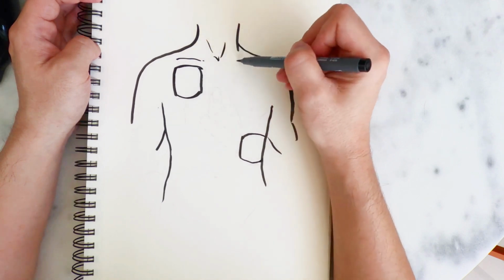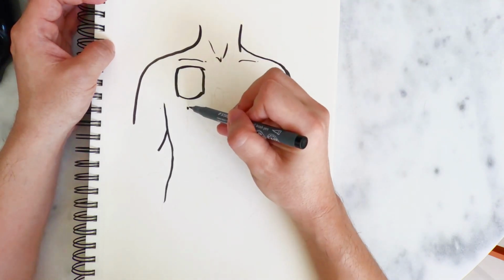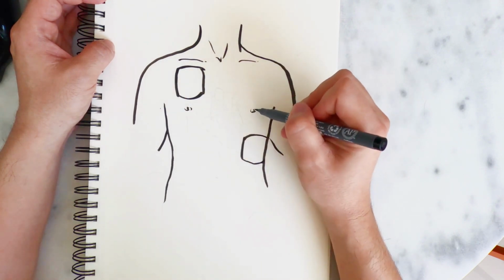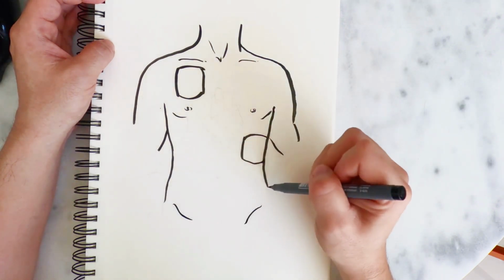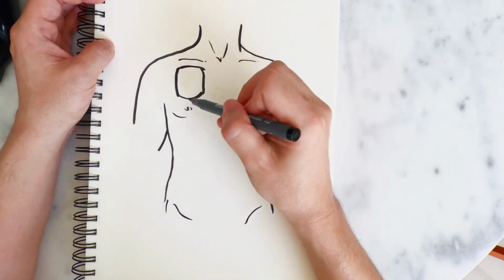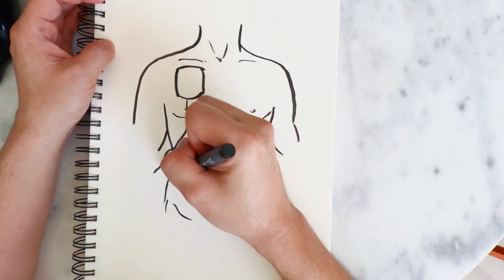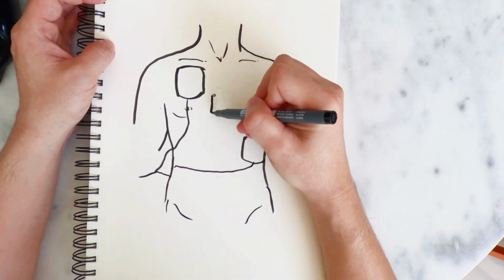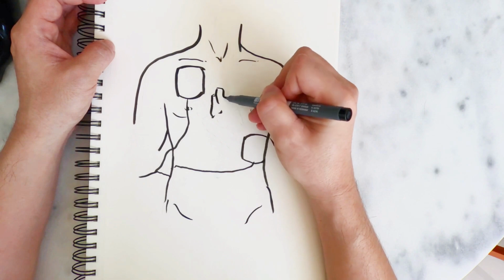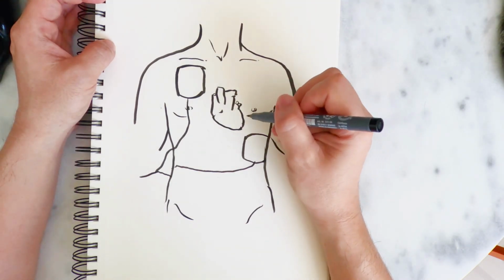If anyone remembers from previous learning, we used to use monophasic, which required 360 joules because the current only flows in one direction, so we needed a lot of electrical energy to deliver the shock effectively. However, currently the device is biphasic, meaning it delivers one shock and then automatically returns, which reduces the energy needed to just 200 joules. I will show you the direction of the current. Now let's observe the direction of the current.